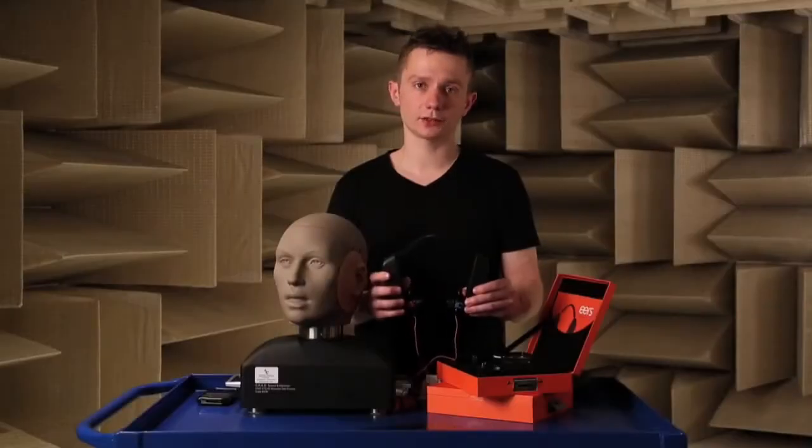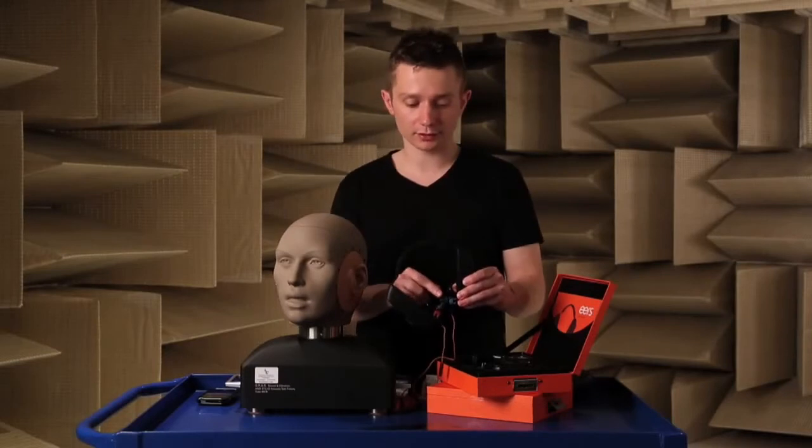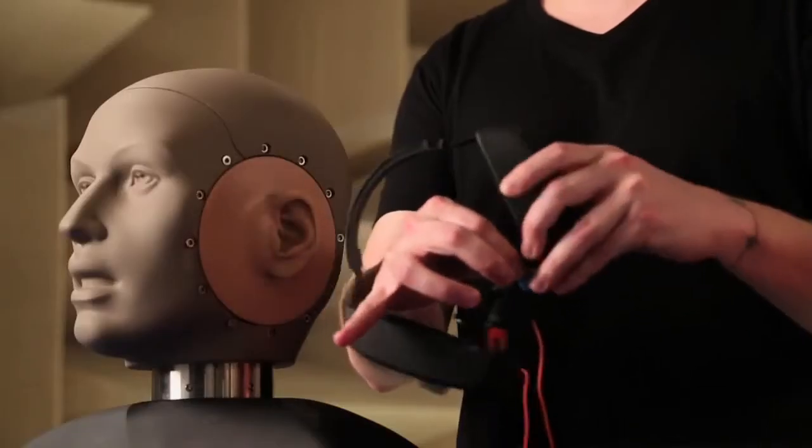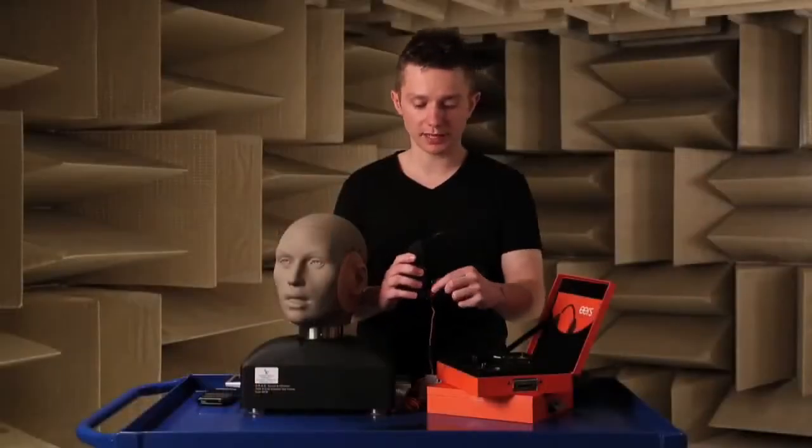To separate the earphones from the fitting system, avoid touching the silicone and grab by the black piece — separate from the blue. Same on the other side: separate the black from the red.